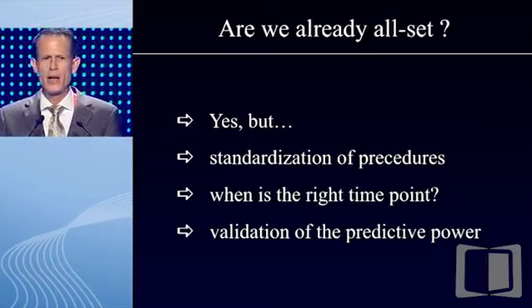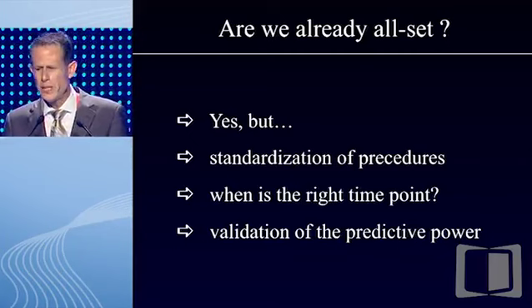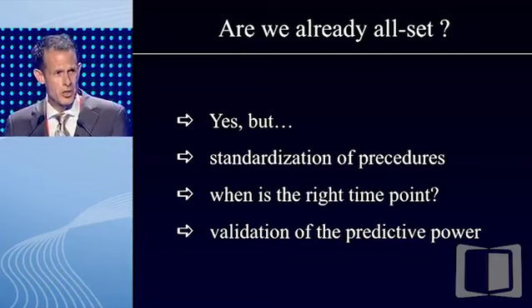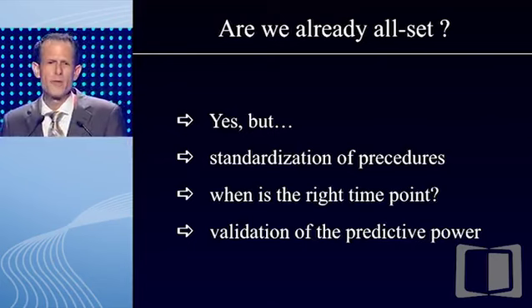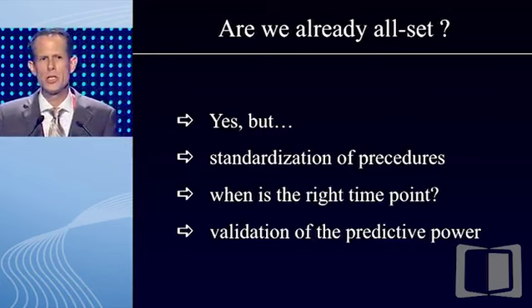So in the end, I would like to ask you these questions from a radiology standpoint. Are we already set up? To some regards, yes, but there are limitations. We have to standardize the procedures. Not every DWI imaging tool works the same in different places. The question is, when is the right time point under therapy to use those tools? And of course, in an ideal world, we would use it even before therapy.